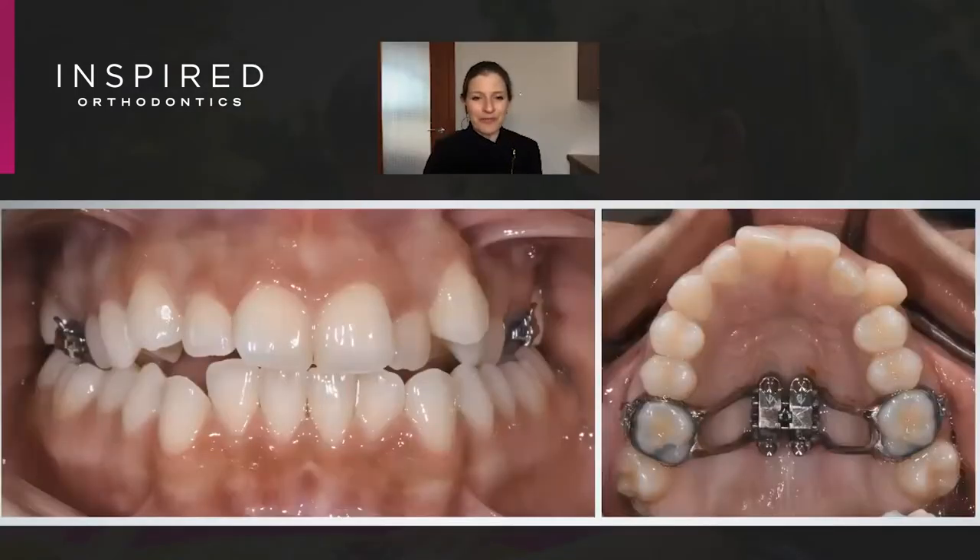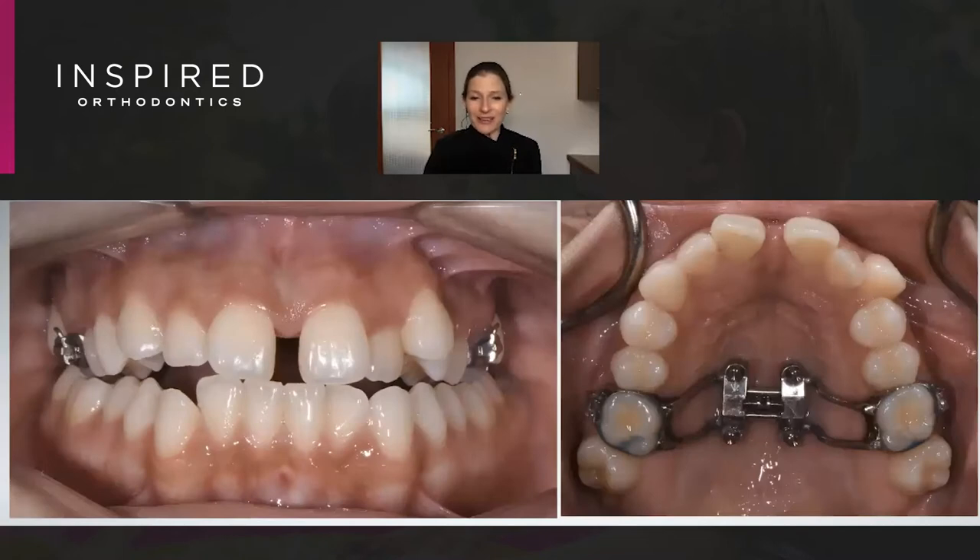This adult female came to us with a unilateral crossbite, and her maxilla is so narrow that we could only physically fit the smallest MSE made — a six millimeter MSE. We were able to get that nice sutural opening, so the sutures are now open, but we've maxed out our expander.